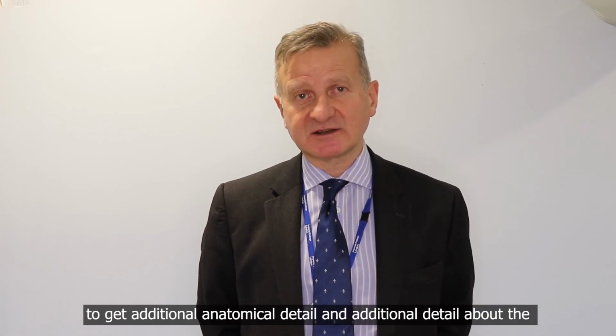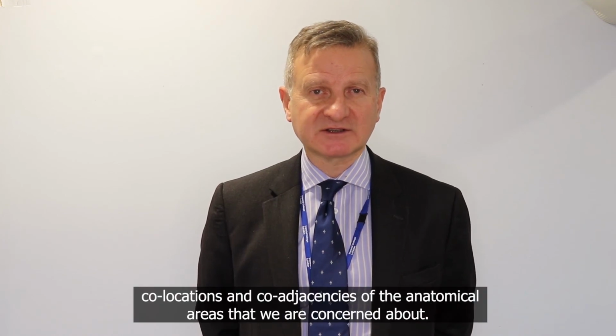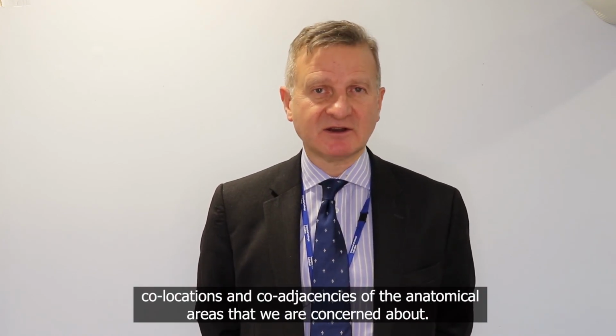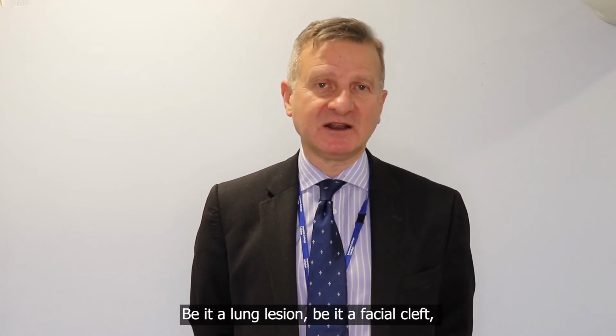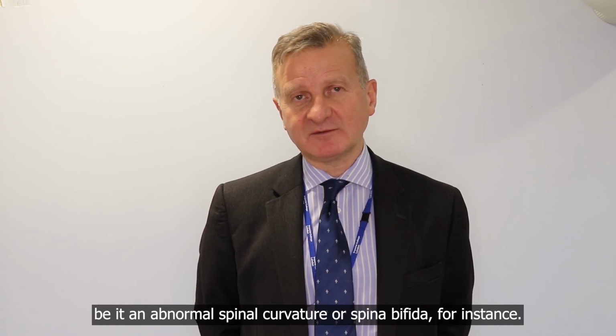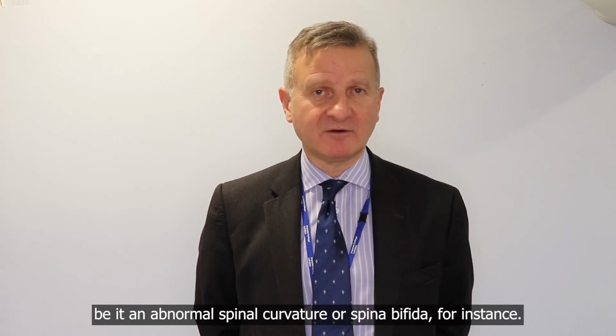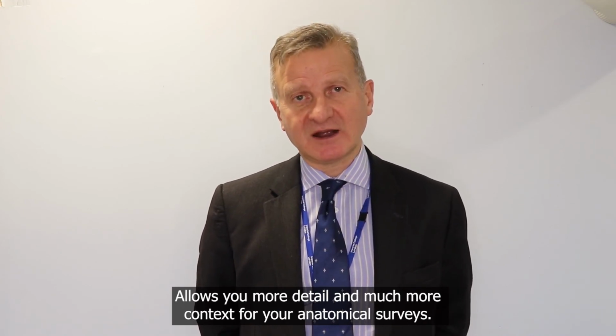So in summary, using CrystalVue and RealisticVue to get additional anatomical detail and additional detail about the co-locations and co-adjacencies of the anatomical areas that we're concerned about, be it a lung lesion, be it a facial cleft, be it an abnormal spinal curvature or spina bifida, for instance, allows you more detail and much more context for your anatomical surveys.